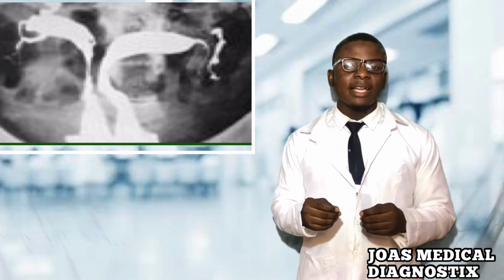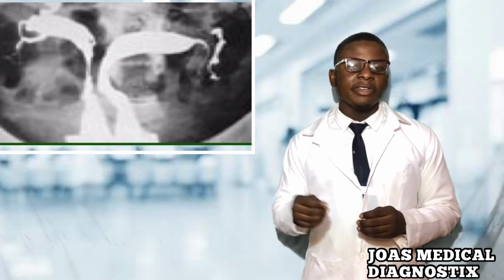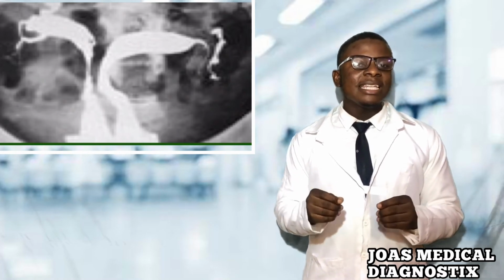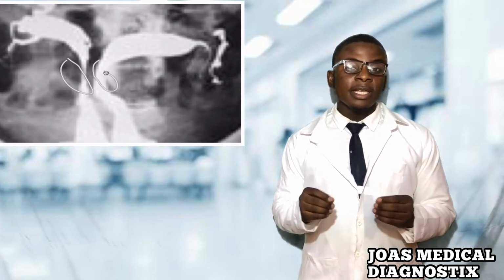This woman has a double uterus or uterus didelphys. That's complete duplication of the uterus and the cervix. She has what looks like a two-chambered uterus, which is correct, but if you look at the bottom of the screen, you can see that she has two separate cervixes as identified by these two catheters. This is an unusual congenital uterine anomaly.